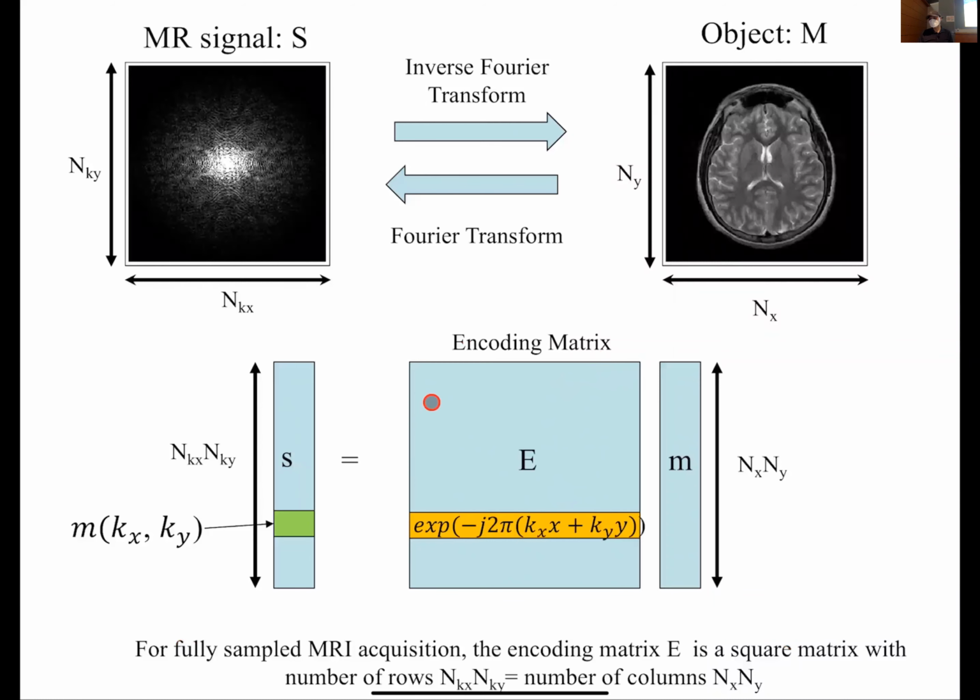It turns out that when we look at parallel imaging, compressed sensing, and deep learning, this is the framework we want to be in, because all of those are going beyond Fourier transforms. Fourier transforms were the bread and butter till about 15 or 20 years ago. That's all you needed to know for medical imaging, aside from some very rarely used techniques that people came up with. Now, in the last 15 or 20 years, especially with the advent of more computing power, that's not sufficient, and the next generation is going to have to be more familiar with looking at things as linear equations.